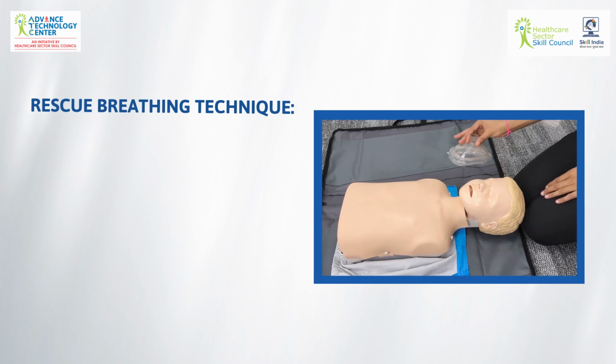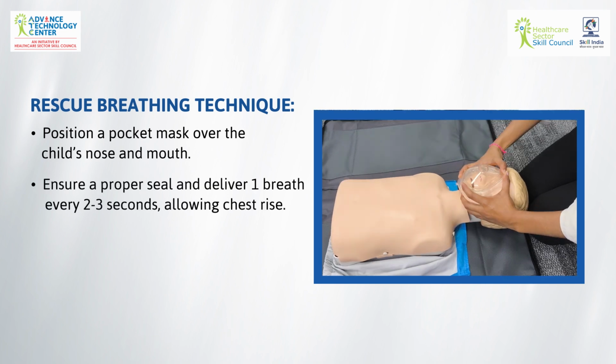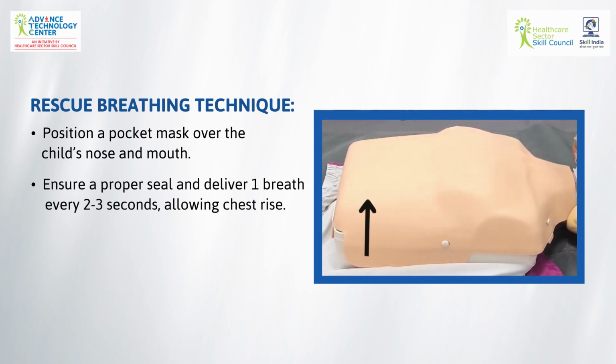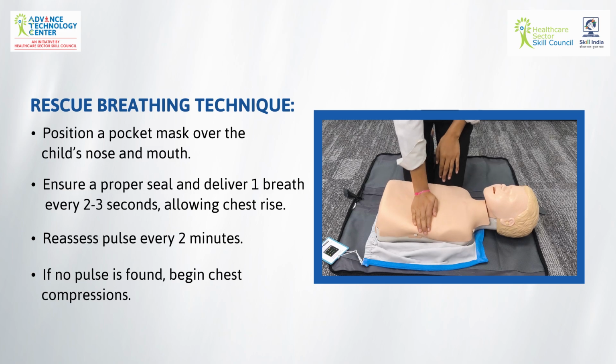Rescue breathing technique. Position a pocket mask over the child's nose and mouth. Ensure a proper seal and deliver 1 breath every 2-3 seconds, allowing chest rise. Reassess pulse every 2 minutes. If no pulse is found, begin chest compressions.